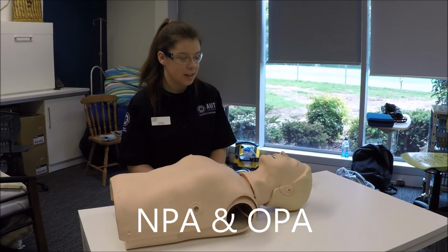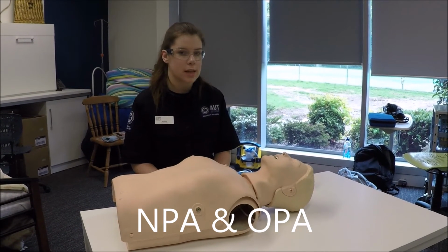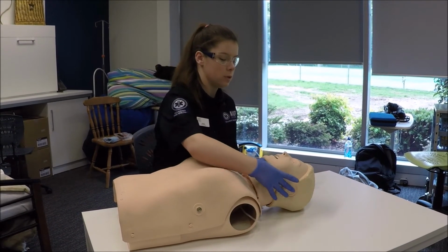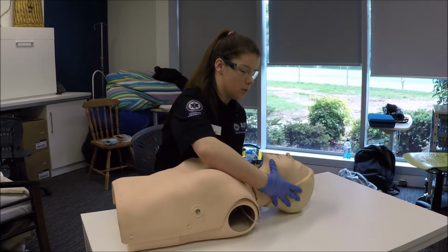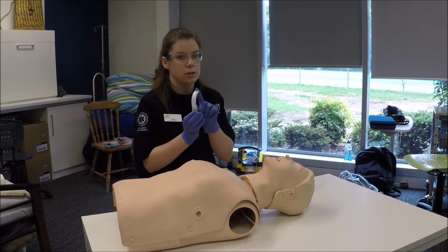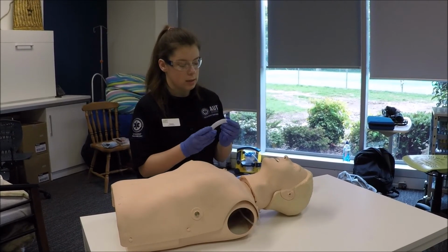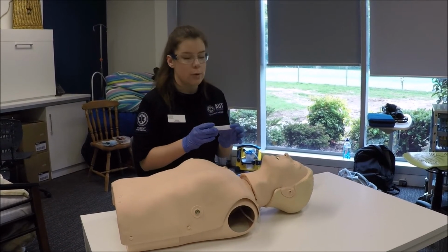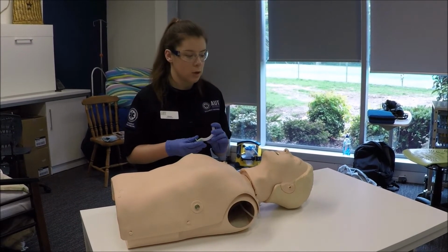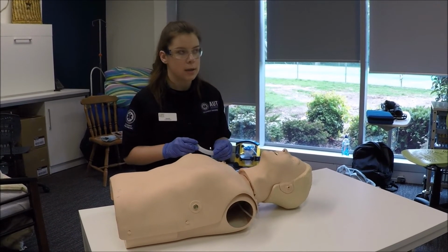So today I'll be demonstrating the use of some airway controls, starting with an OPA. So before we insert it, we'll use a head tilt chin lift to open up the patient's airway. This is the oropharyngeal airway, and we use this with patients with a GCS of lower than 8, specifically a verbal response less than 2, and so they're unable to maintain their own airway.